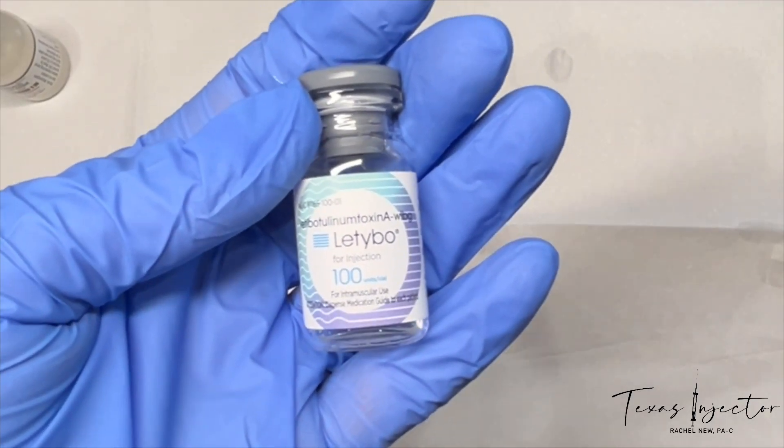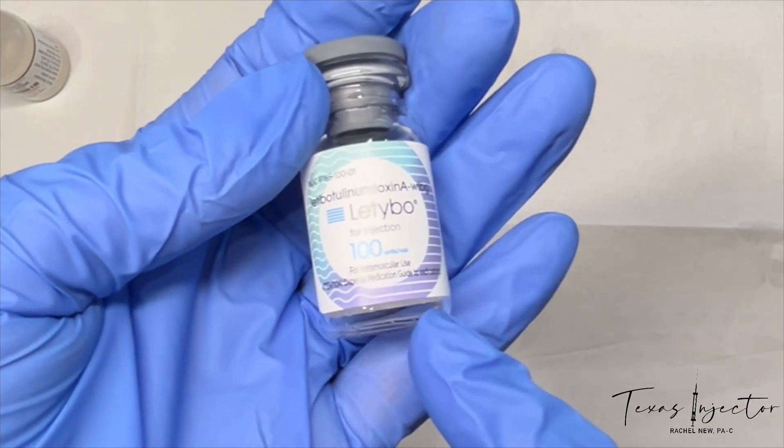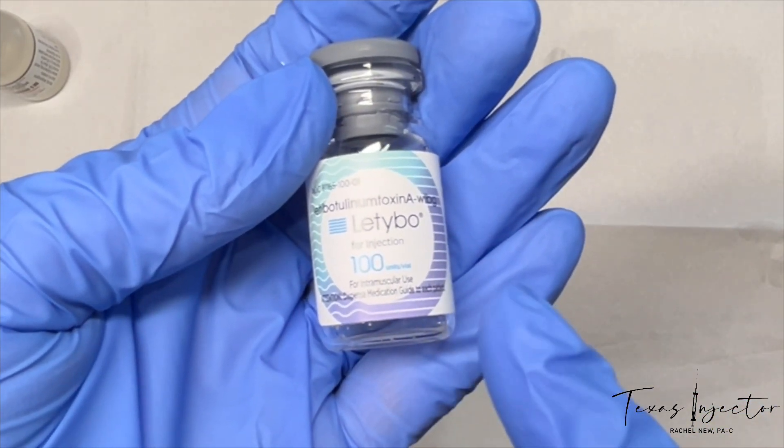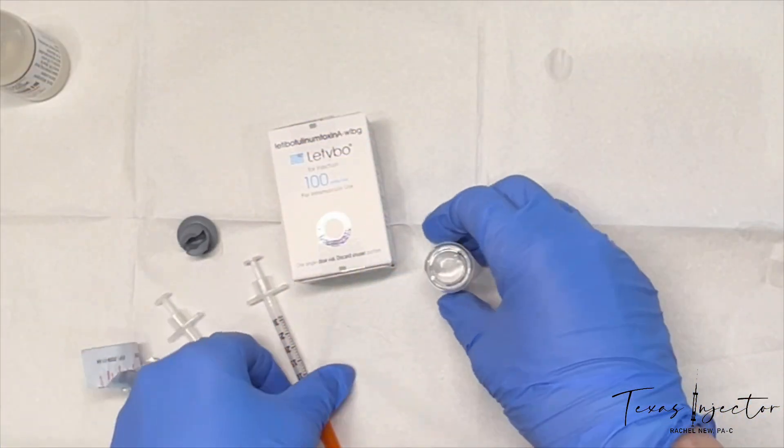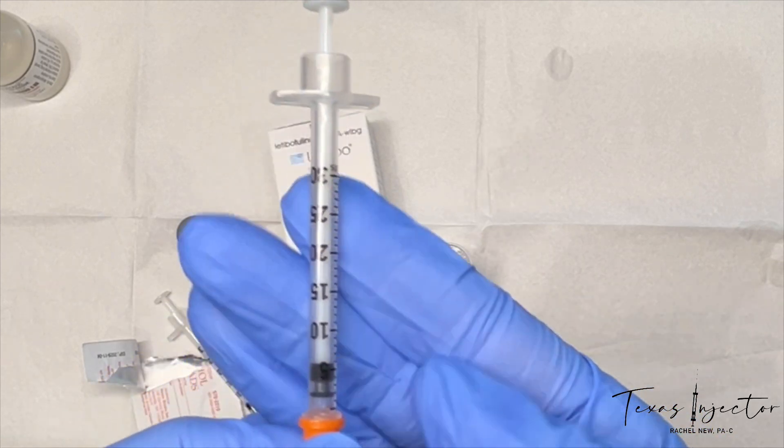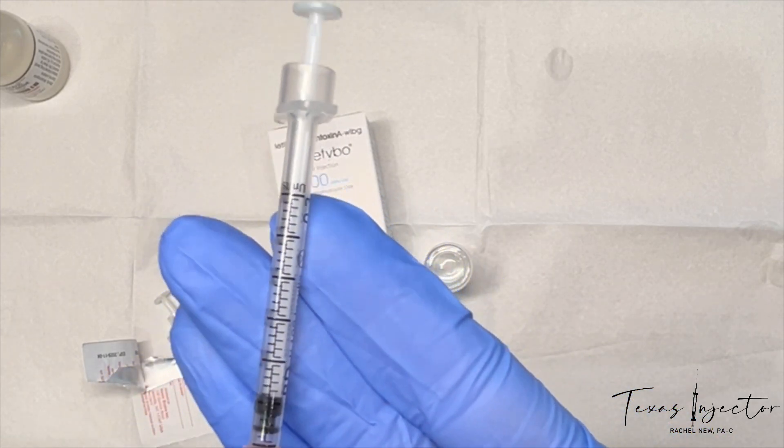Now that we have added 2.5 ml of the bacteriostatic sodium chloride to the 100-unit bottle of Latibo, let's draw it up so we get an idea of how to dose this. I have a 30-unit insulin syringe.